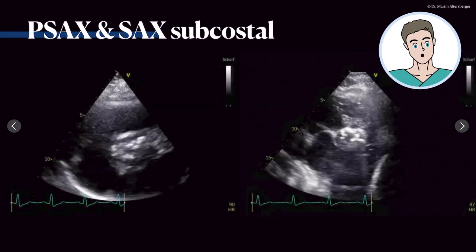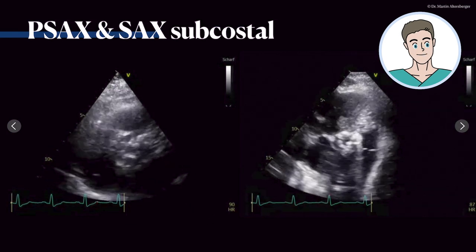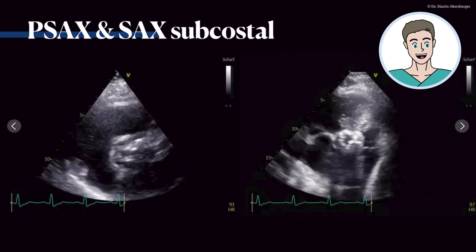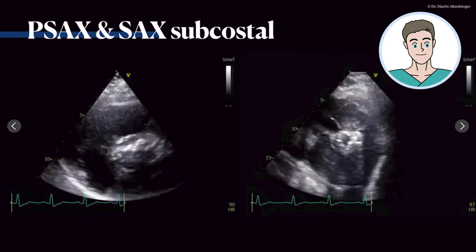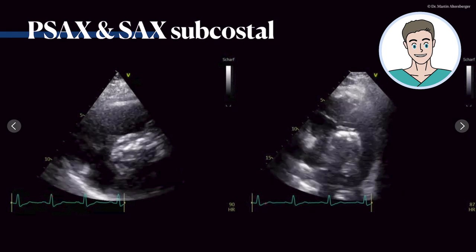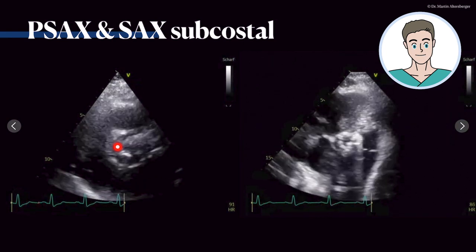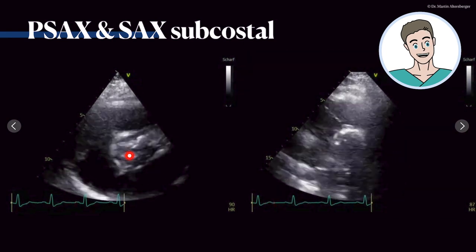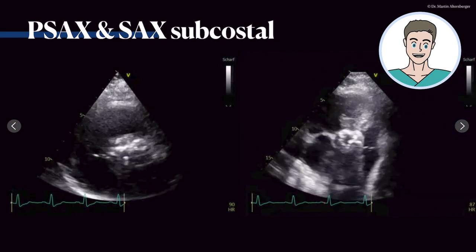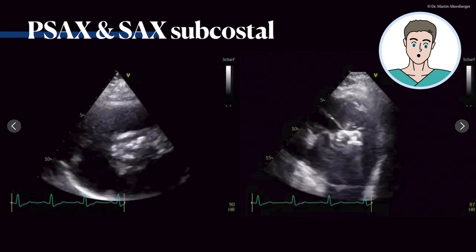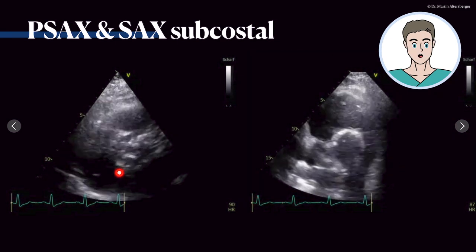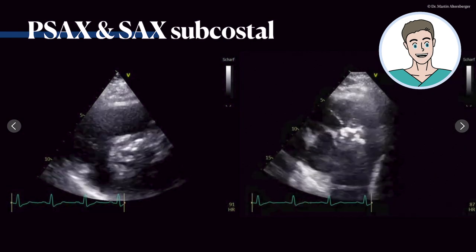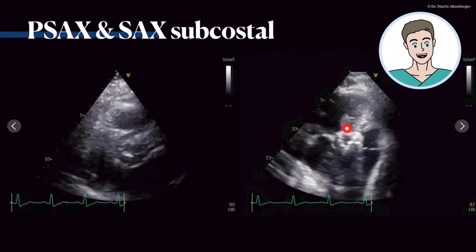Let me take a look now at Ernest's case. Here in the short axis view it's very hard to differentiate individual cusps because it's simply just severely calcified. There is probably a little bit of opening left, and if you do not have an optimal view from the parasternal short axis, you can also choose a view from a subcostal approach.